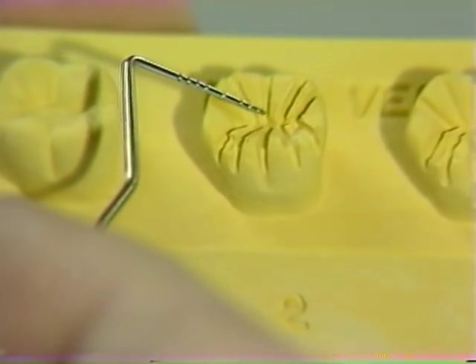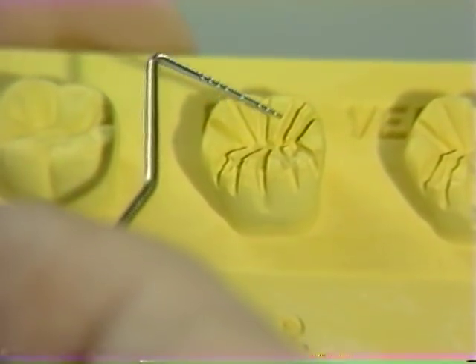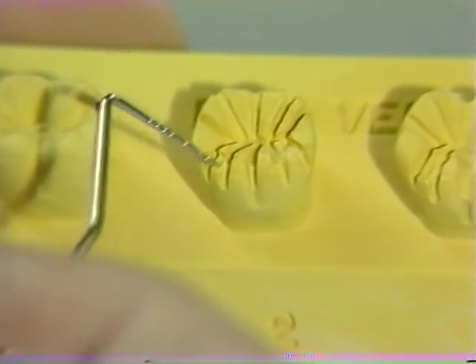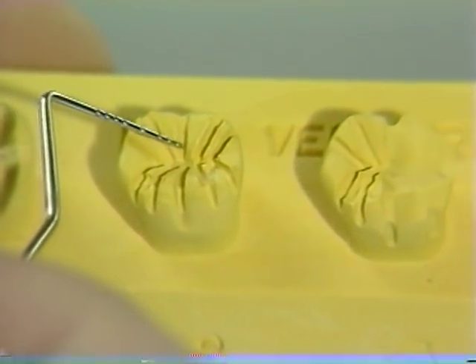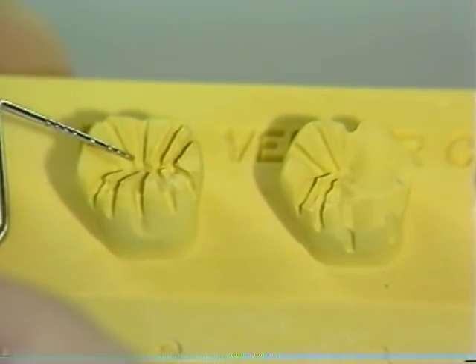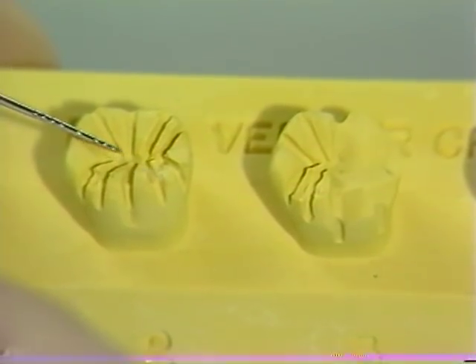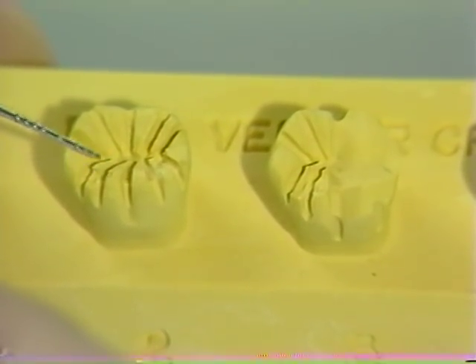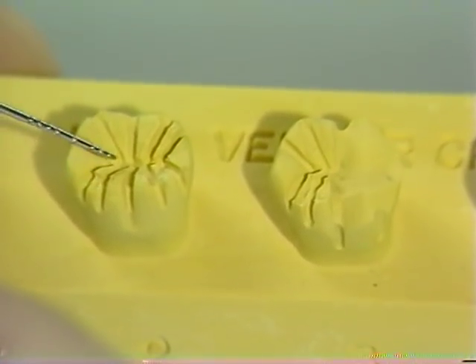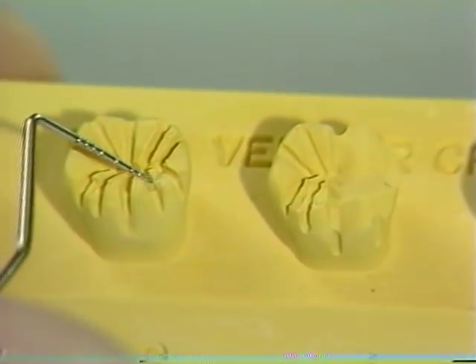These grooves will be placed in all of the fissures and at the crest of the triangular ridges. Remember that the depth grooves on the non-functional cusps will have to be approximately one millimeter in depth, whereas the depth grooves on the functional or buccal cusp — remember this is a mandibular molar, so the buccal cusp is the functional cusp — have to be approximately one and a half millimeters in depth.